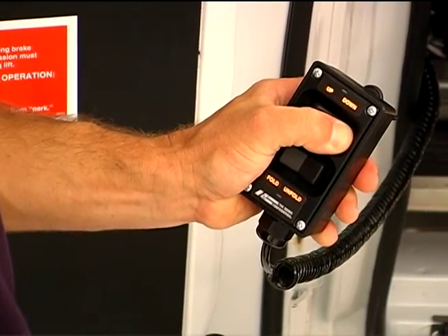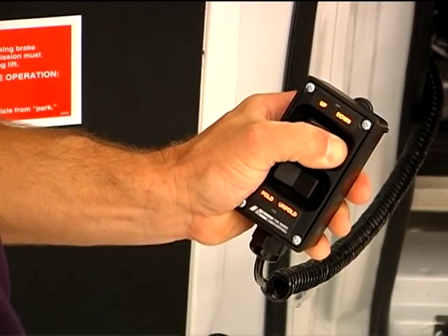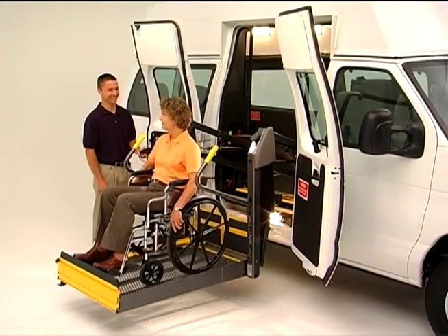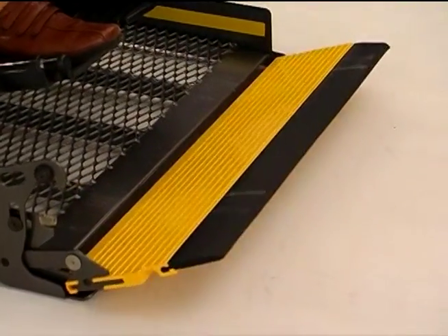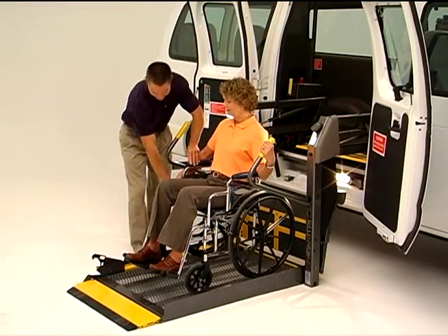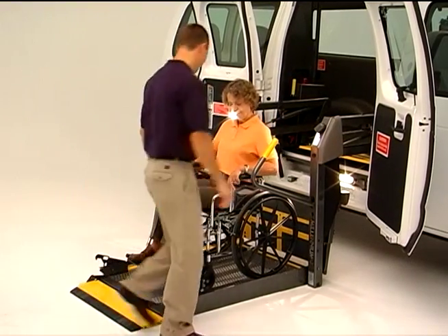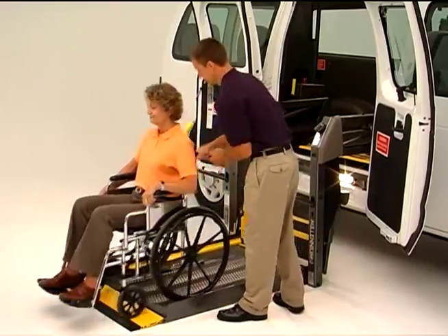Once the passenger is in position, press and hold the down button on your handheld control until the entire platform reaches ground level and the outer barrier unfolds completely. When all movement has stopped, unlock wheelchair brakes, switch on wheelchair power if necessary, and unload the passenger from the platform.